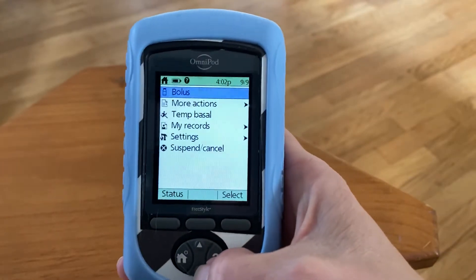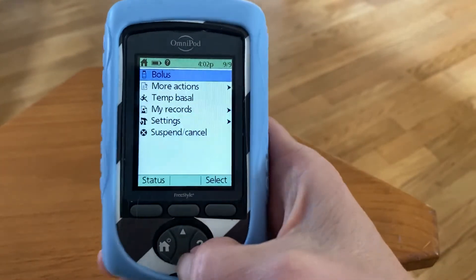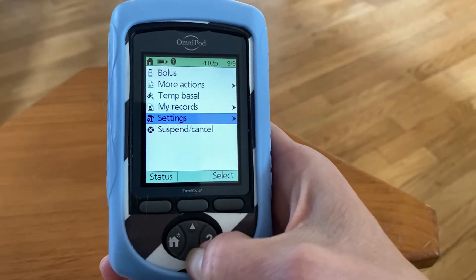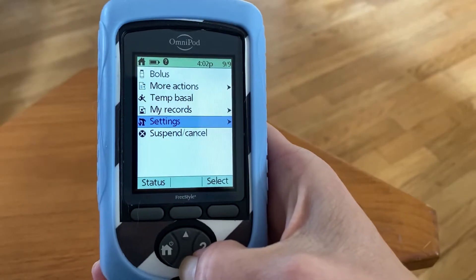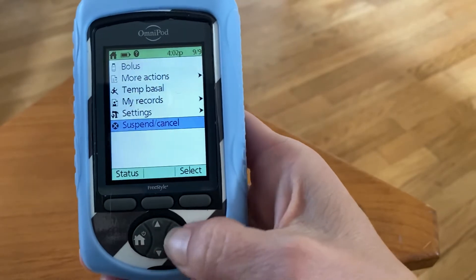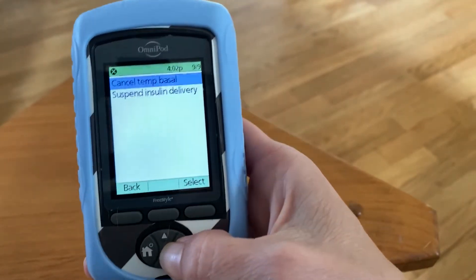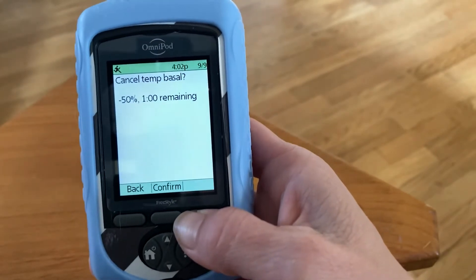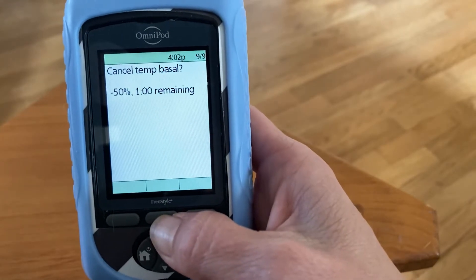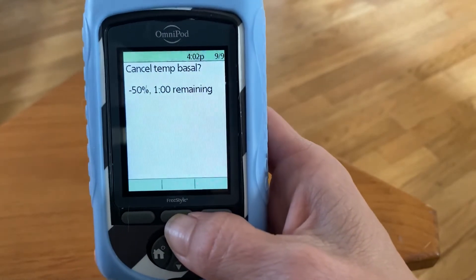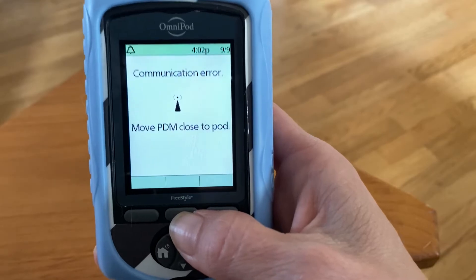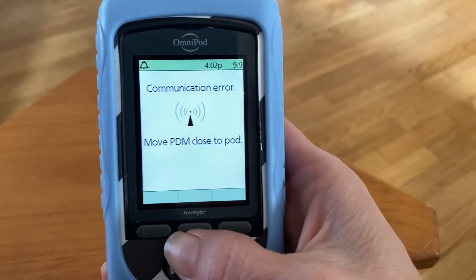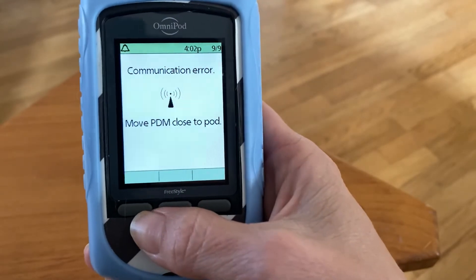Once you see her blood sugar is coming back up and you don't want the temp basal on anymore, you just go down to where it says suspend or cancel, select that, and then say cancel temp basal and confirm. Again, she's too far away, so I should go find her to turn off that temp basal decrease.